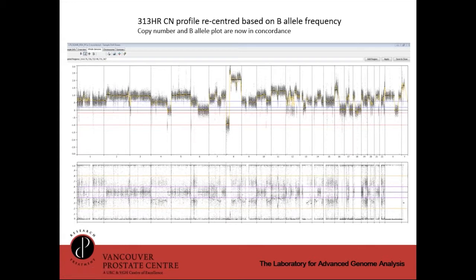So what's actually happened in this particular case is that we've seen the entire genome has been duplicated, and this is actually a tetraploid situation. And I use Nexus just by grabbing that call line here, putting in that location in diploid here, and then just hitting apply, and this moves this up for me in one fell swoop, which is extremely valuable.